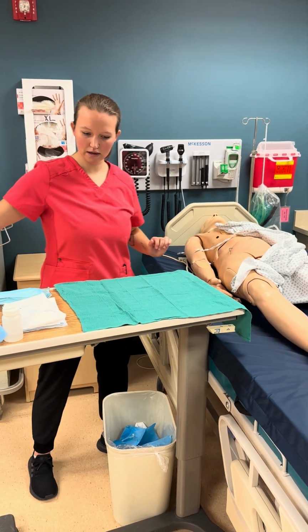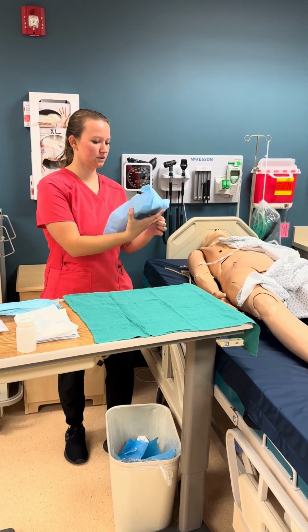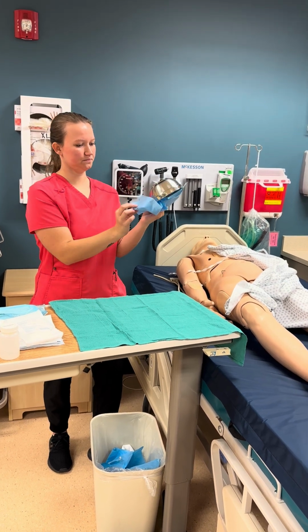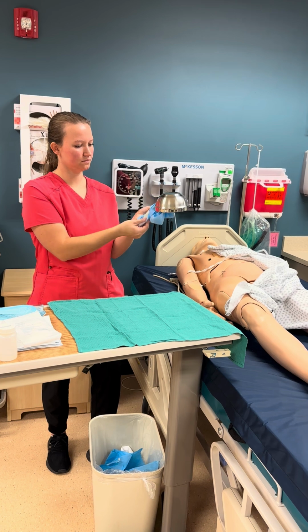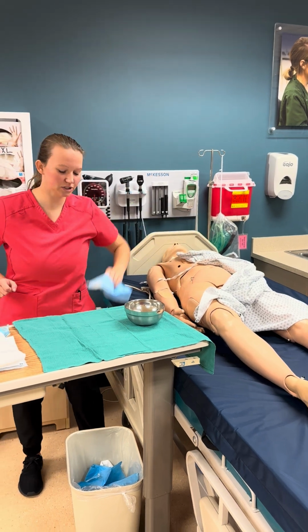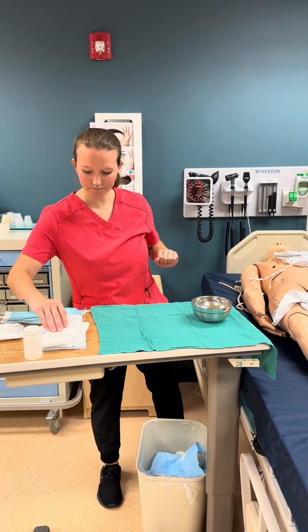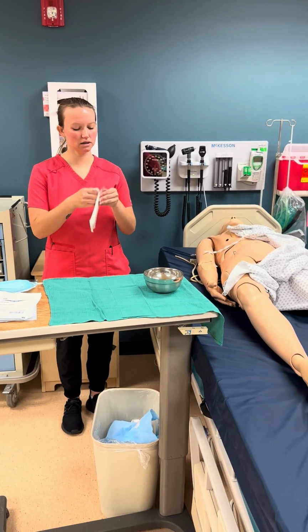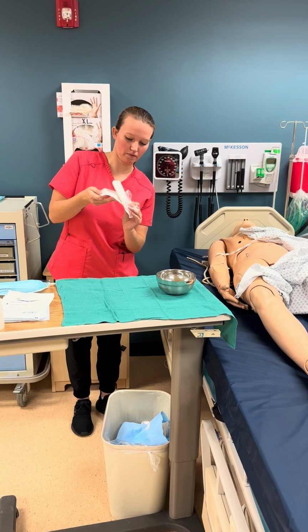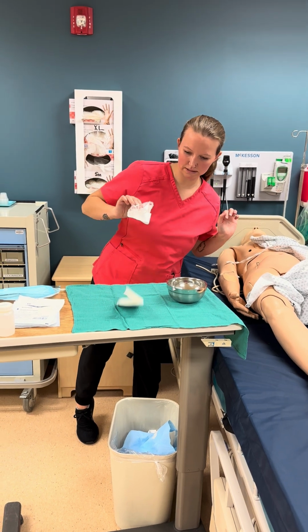Okay. Still doing okay, Joe? You're comfortable? Yep. I'm going to step back while opening these here. I'm going to grab the edge. And I can put this here. Remembering sterile can touch sterile, and that 1-inch border. Got stuck to my hand. Okay. I'm going to step back. Just drop it on there.